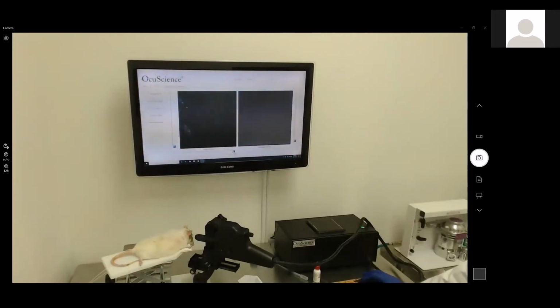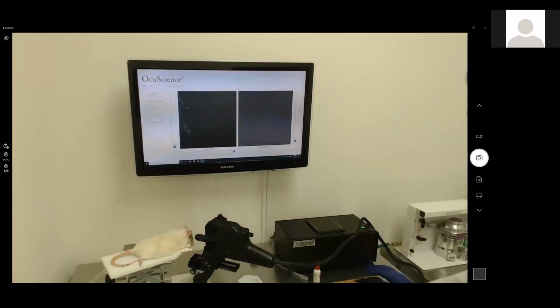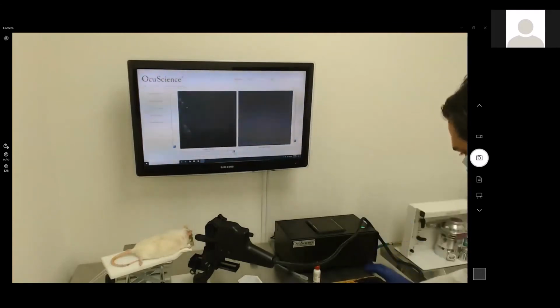On this, the same as when I captured our images earlier, we had 16 of them, but now doing the volume scans, we can go upward to 512 different images. As I'd mentioned earlier, and Daniel had also mentioned, it was scanning horizontally through the eye, and we can go through and review all of the different images that were taken.